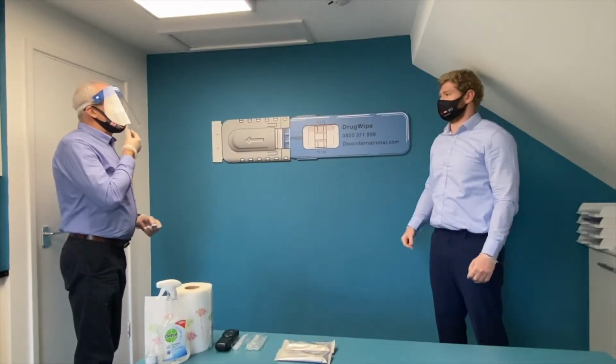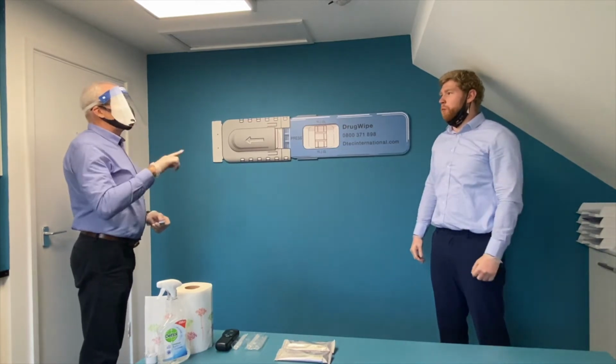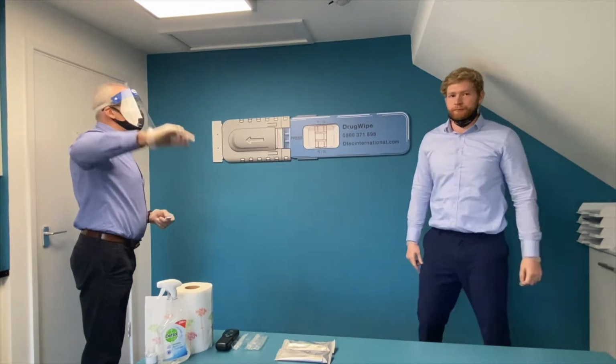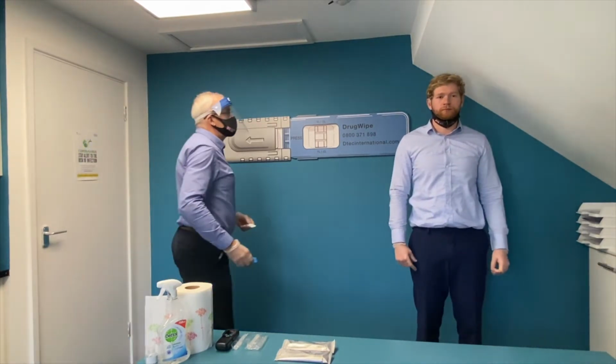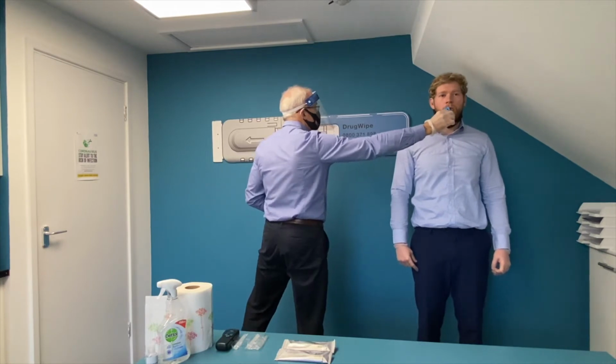To ensure the tongue-in-cheek step is done correctly, ask the employee to pull down their mask so that you can monitor this part of the process. To take the sample, please follow previous guidance. Ask the employee to face away from you, look at a focal point on the wall, move in from the side and sample at arm's length.